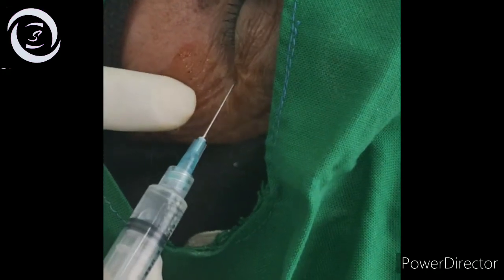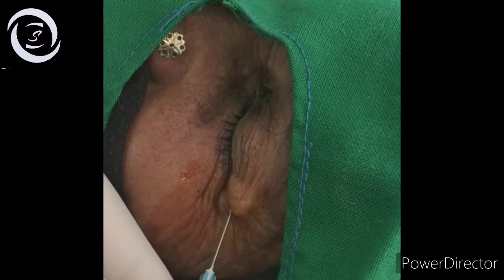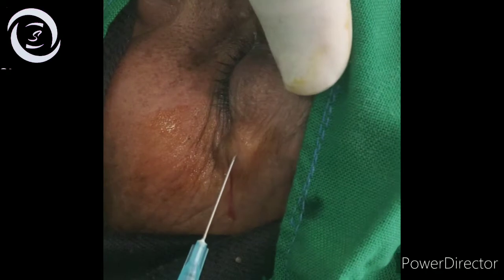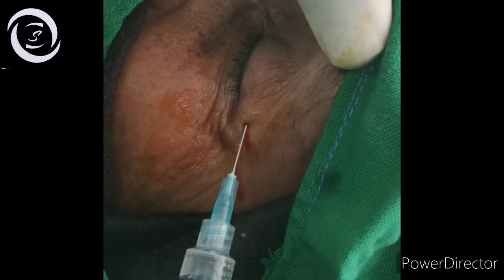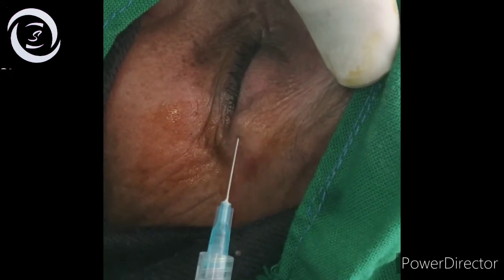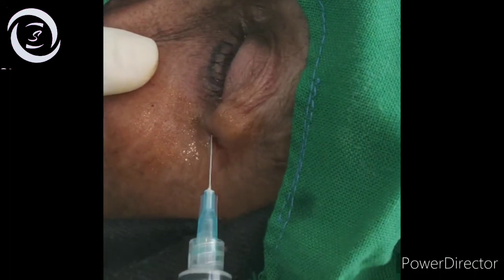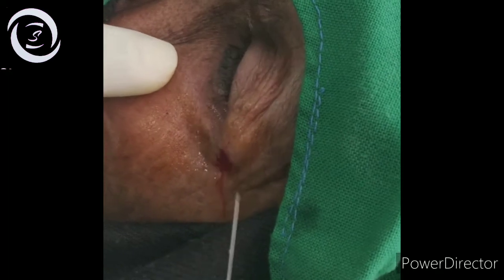The modified Van Lint technique anesthetizes the facial nerve branches to the upper and lower eyelids. Facial block is usually indicated in oculoplastic procedures like blepharoplasty, lid procedures, and with retrobulbar blocks. It is also required in uncooperative patients with excessive blinking and forceful squeezing of the lids.